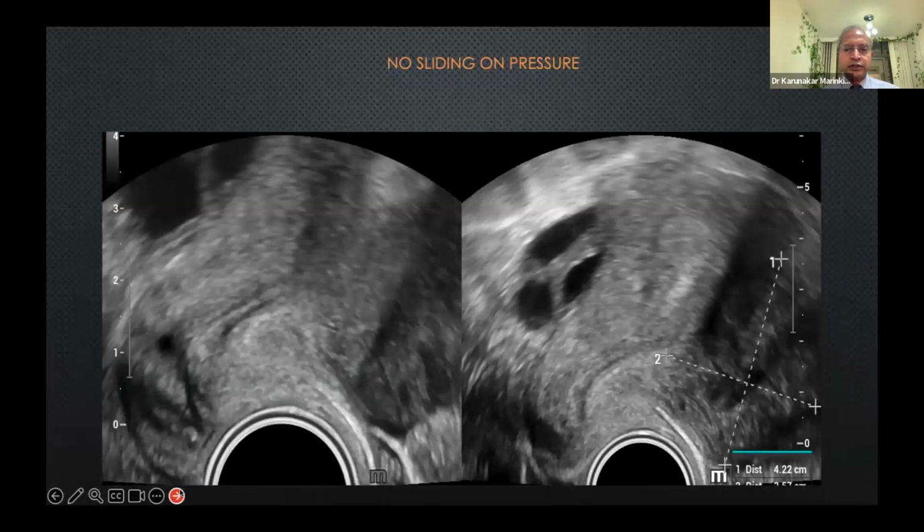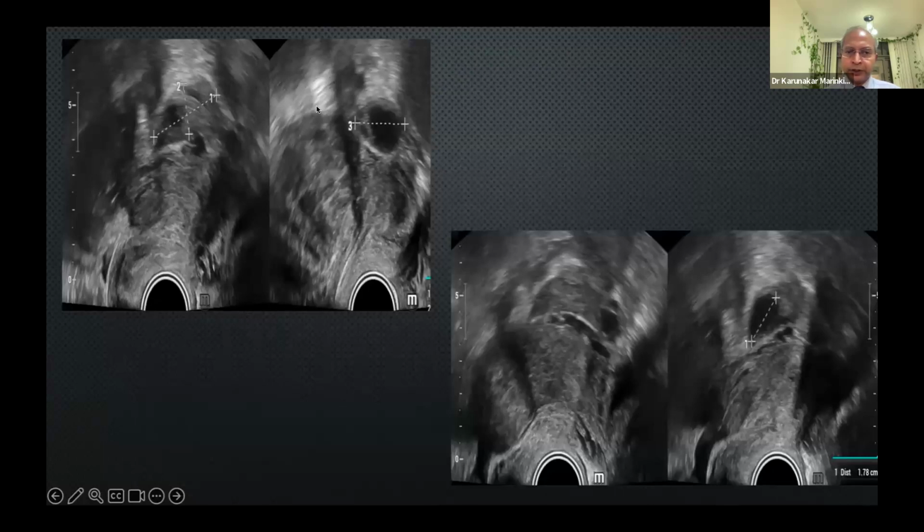One more thing I want to discuss about endometriosis is that you may not see the entire spectrum of endometriosis. This is where laparoscopy comes into play. There are people who have myoma, adenomyoma, plus pelvic adhesions. You may not be able to see ovary as ovary, follicle as follicle. Hydrosalpinx may look like this. So complex adnexal findings are the ones which need you to understand, rather than just an intra-ovarian small endometrioma that you just go and remove.